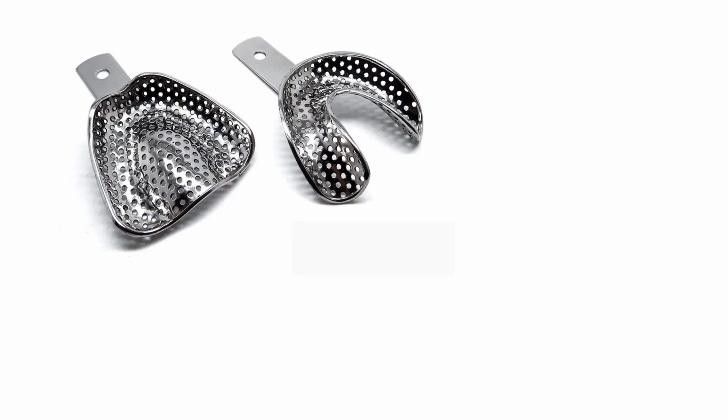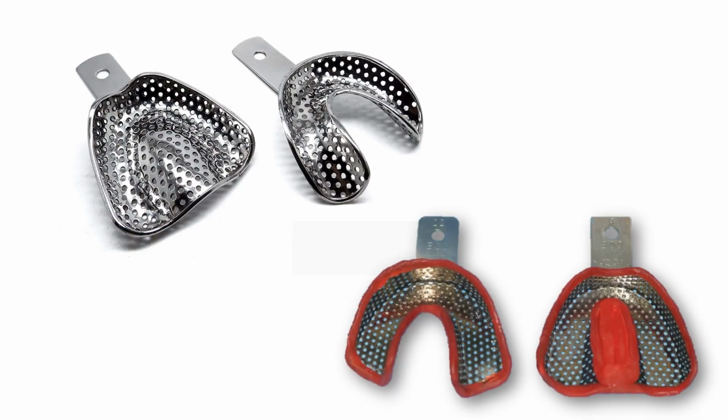What's available in the clinic? You'll have metal stock trays. You'll modify metal edentulous trays with rope wax to better adapt to your patient's anatomy. For this course, you'll be using the 3D printed stock tray shown previously.